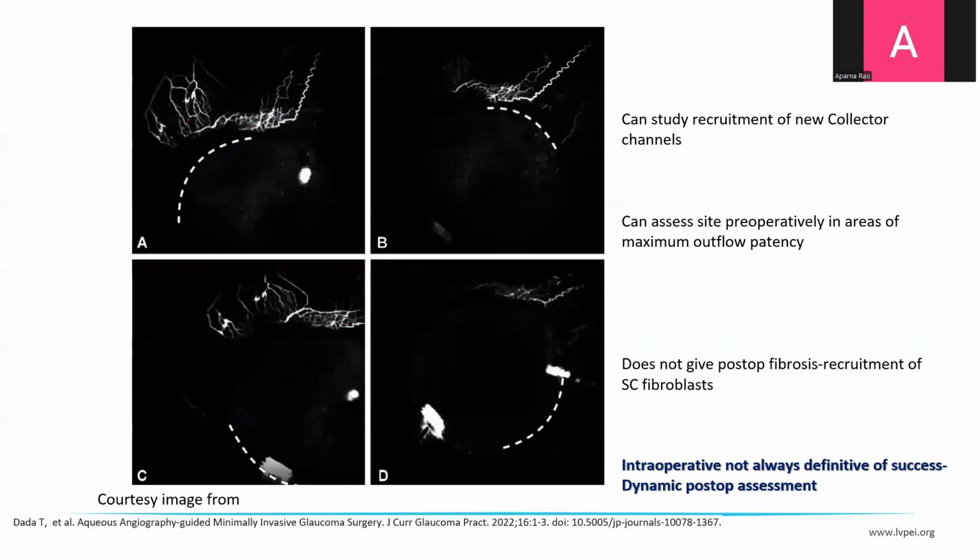Aqueous angiography and OCT angiography are new techniques that allow us to visualize not only the distal outflow pathway during surgery, but also demonstrate the recruitment of new vessels in the region of the surgery, suggesting a favorable outcome.